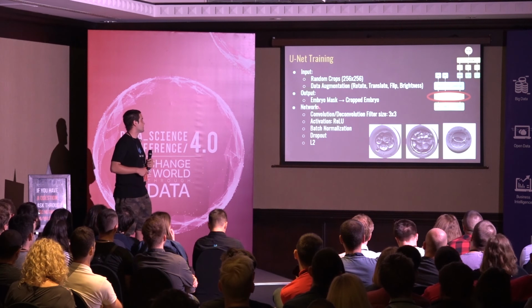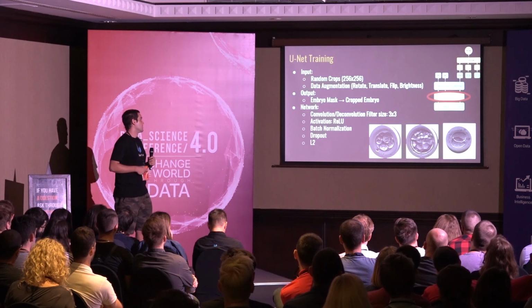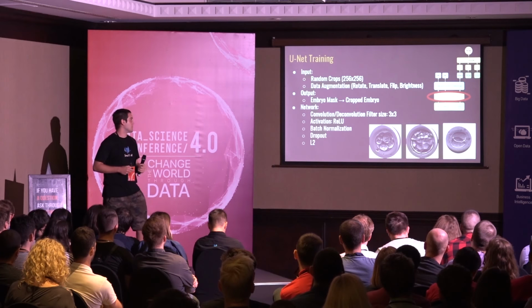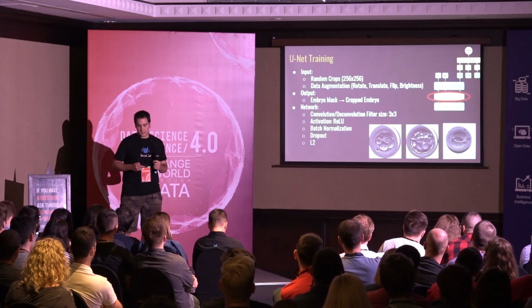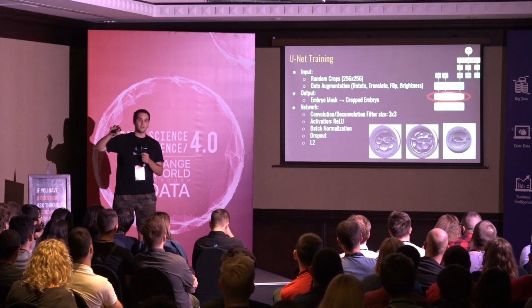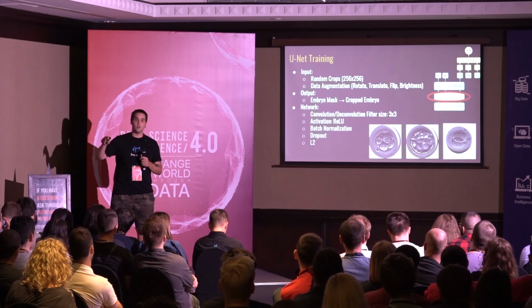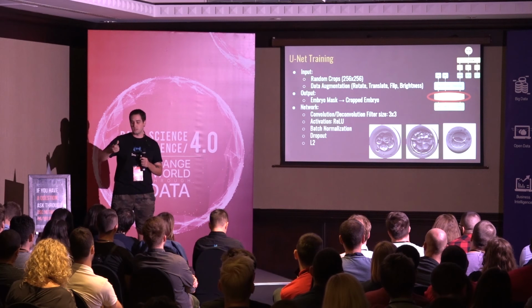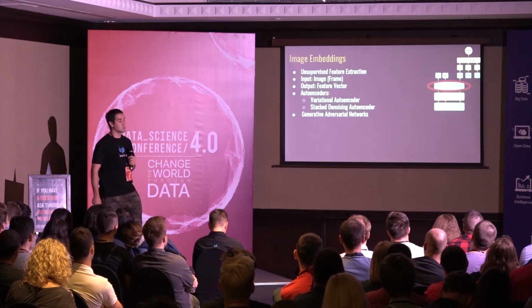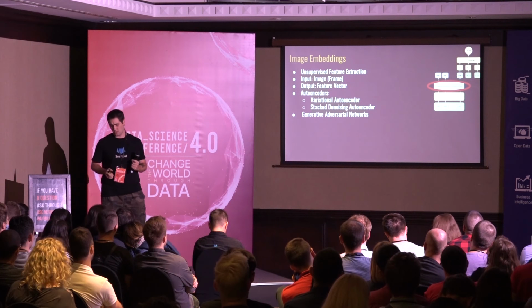We used some standard convolutional filters, 3x3, with ReLU activation and batch normalization. Now that this is trained, we can apply this binary mask on the frame, extract the embryo, center it on the image, normalize the image, and then this image is ready to go into the feature extractor. Or whatever.